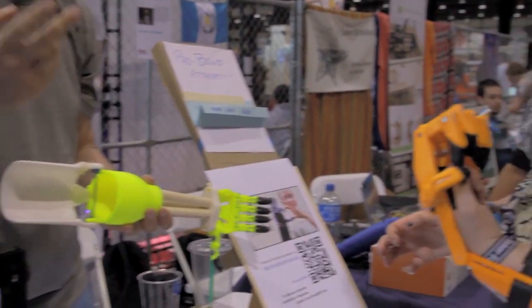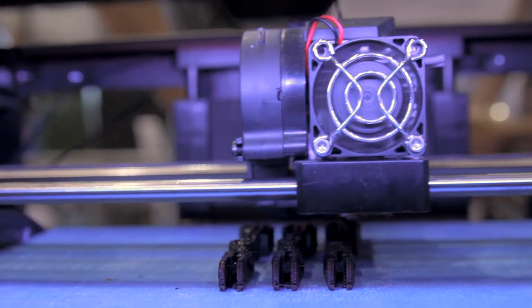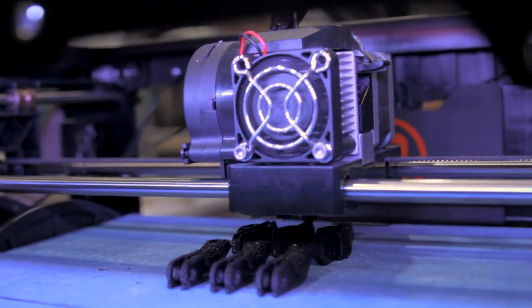We've had people in our community actually purchase 3D printers exclusively for designing and making new hands for their children as they grow. So in terms of the nature of the problem and the nature of the technology, they're very well suited to each other — customization, distributed manufacturing, and low cost.